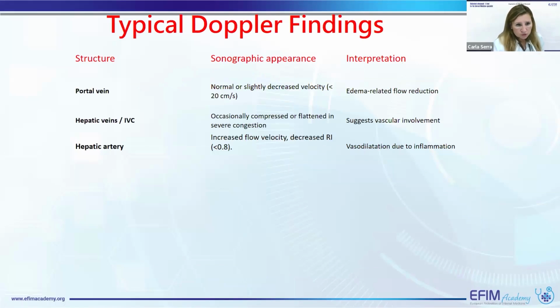Now we move to Doppler evaluation, because we have also changes in Doppler flow in the evaluation of the portal vein, the suprahepatic veins and the hepatic artery.